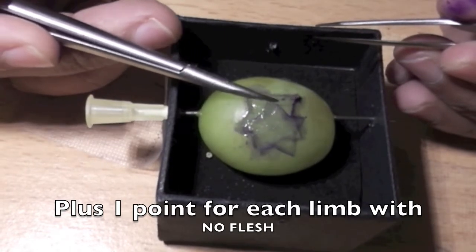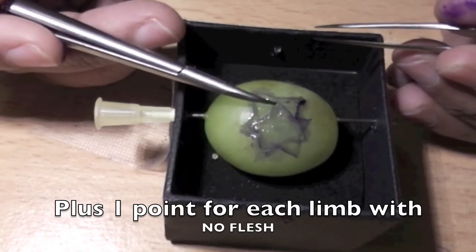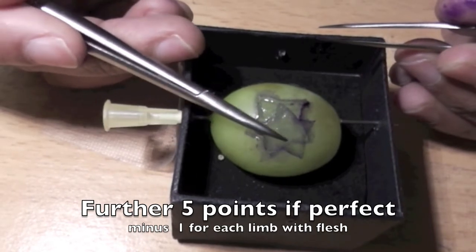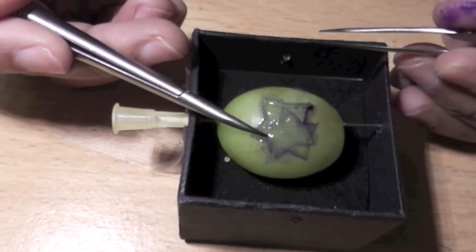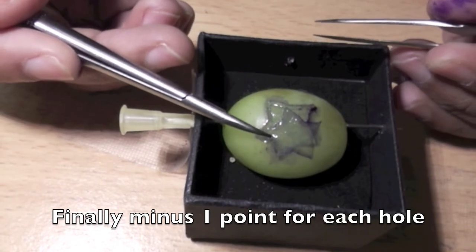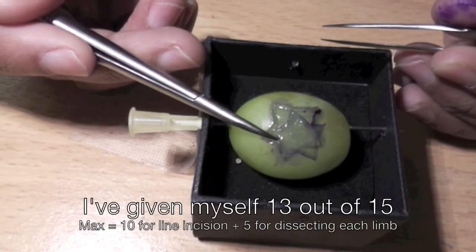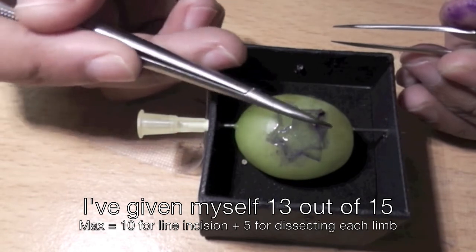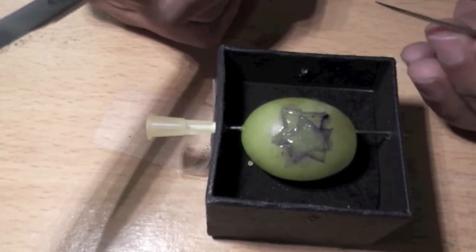There's no flesh remaining on any of the limbs, which is good. No flesh here, further one point; no flesh here, two points; no flesh here, three points; four points. Actually, I have left some flesh here - you probably can't see it under the microscope. So I'll give myself four out of five for leaving flesh on the limb, and I minus any perforations. I've made a hole there, so that's another minus point. So ten plus four for the limbs is fourteen, then take away one point for making a hole - that's thirteen out of a potential fifteen.